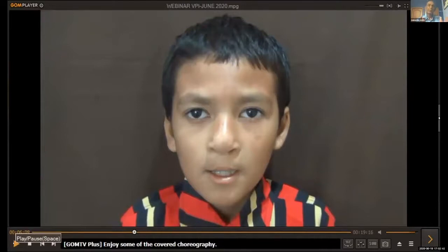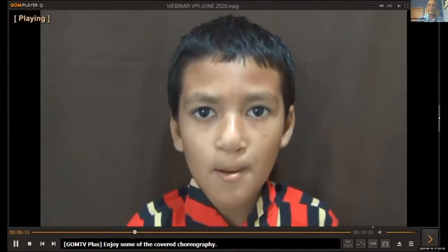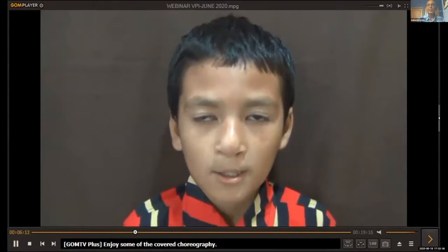This is about nasal endoscopy. It is as simple as that. You just pass the soft scope with it slightly flexing so that it goes through the soft palate. Then once you visualize, quickly give the stimulus that you want to see. You don't need to record the whole thing like we did for a speech recording. For example, this is the speech recording. It has a reasonable length of.